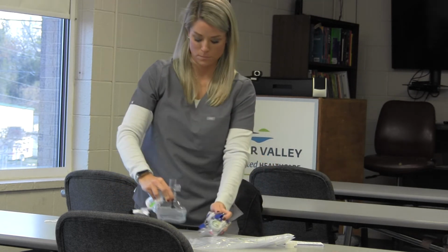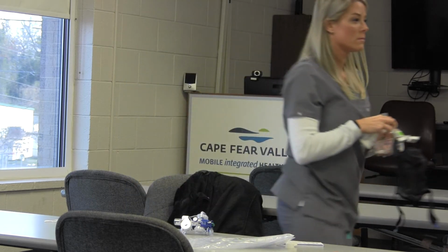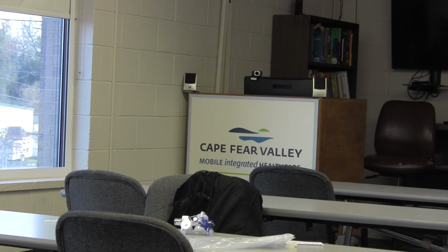Let's see. Might as well go ahead and grab the strap too. Yeah, well, I said elbow. I do like how you can control the flow though, and it's not just wide open all the time. So you're not gonna have your tanks empty as fast. It's more complicated than the other CPAP nebulizer. Just keep on putting pieces and parts together until it works, right? That's pretty neat.